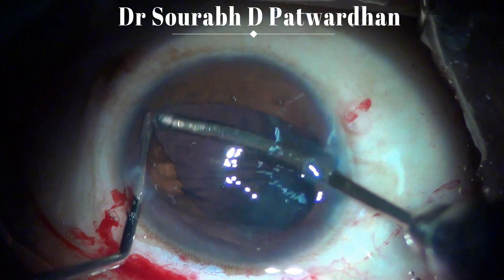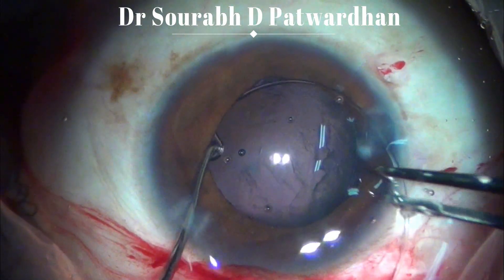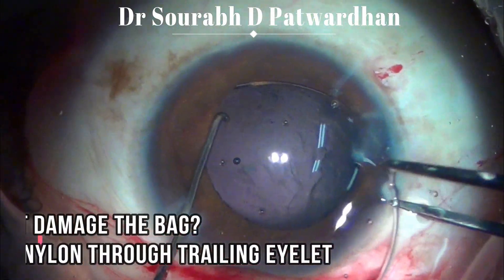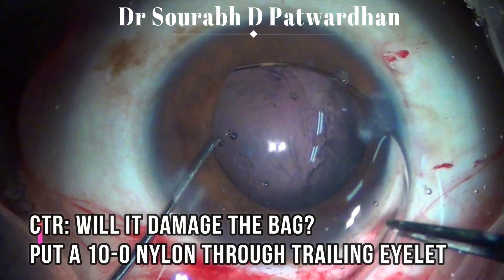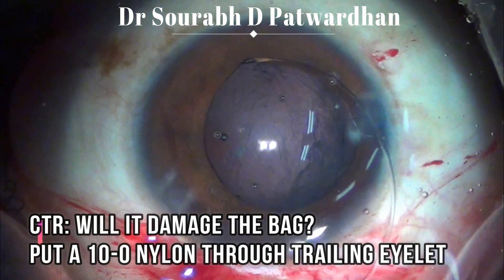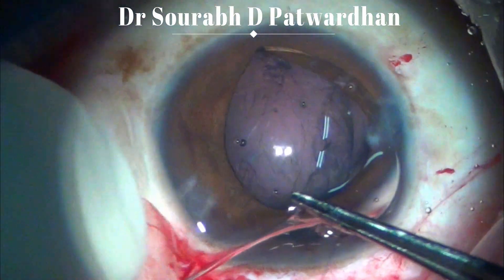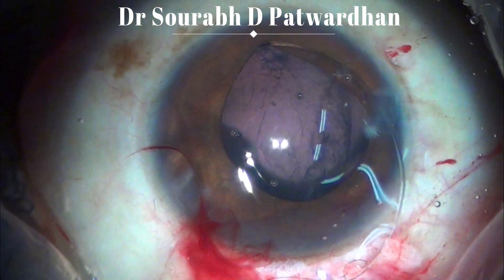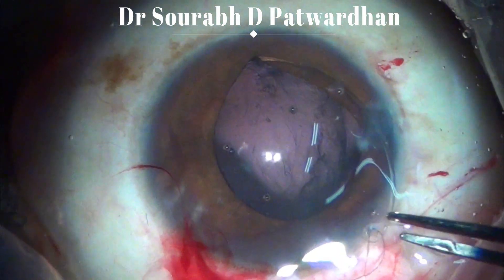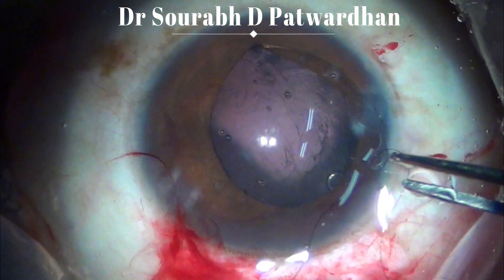I will do dry aspiration of the cortex here just under the viscoelastic. Now you can see the insertion of the CTR, using a second instrument to support it so that it goes into the bag. Here I am not sure of the capsulorhexis, so in case I insert the CTR it might tear apart the capsulorhexis or the bag, and I may lose the CTR into the vitreous.